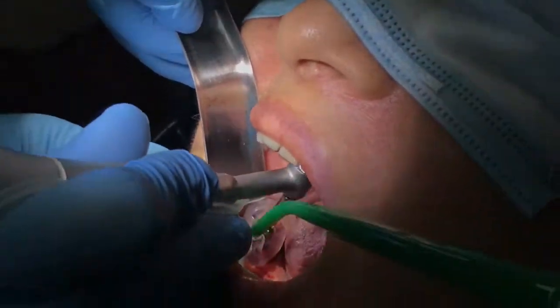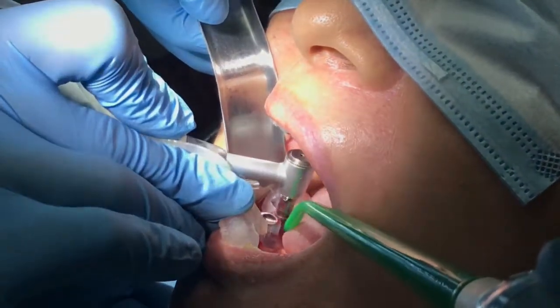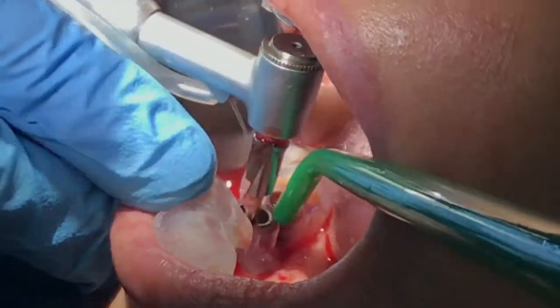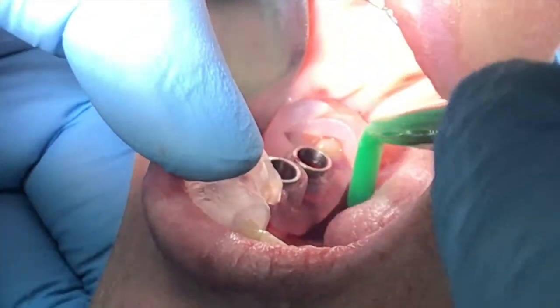This is considered the third generation of guided surgical protocols. In the first generation we didn't have keys — we had several guides. In the second generation, introduced by Nobel BioCare, we had keys, and now Blue Sky Bio has introduced the third generation, which is keyless.